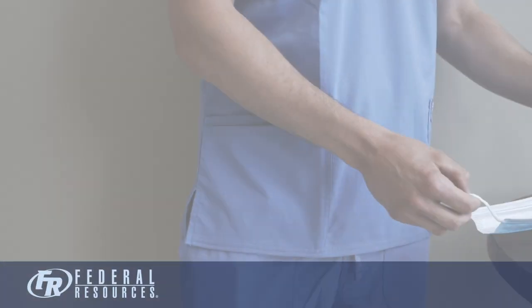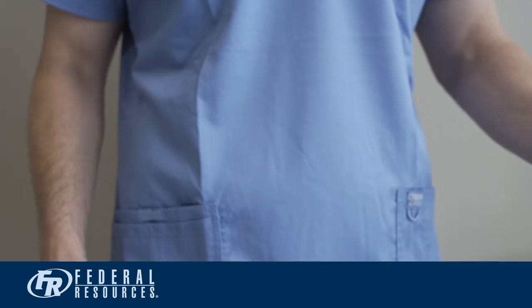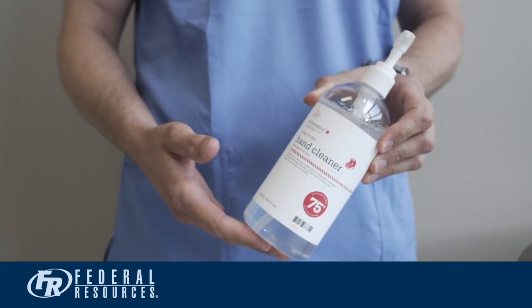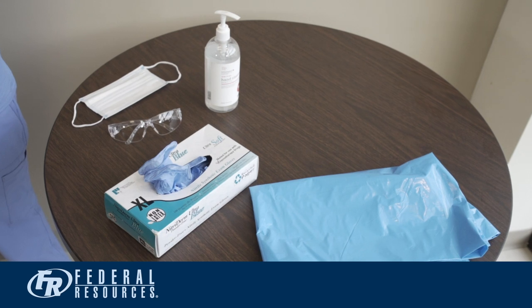First, gather the necessary supplies. You will need a mask, an impervious gown, eye protection, nitrile gloves, and alcohol-based hand sanitizer. Place your equipment in a clean area where you can safely don your PPE.